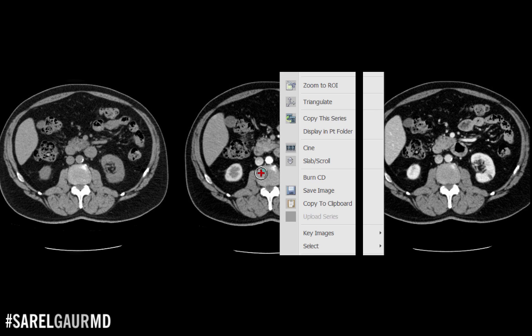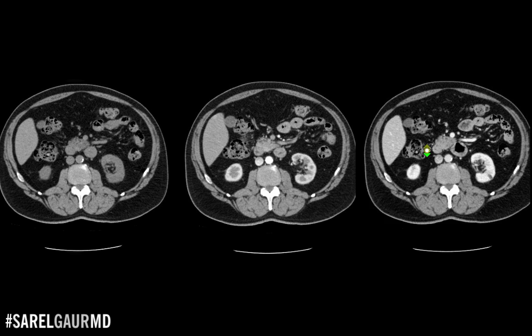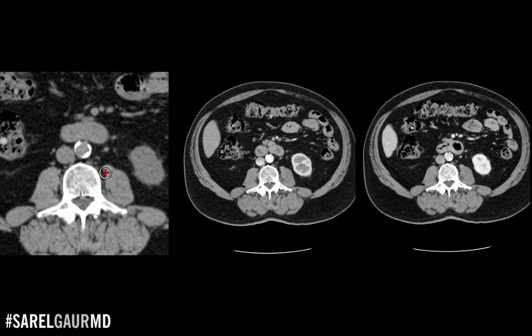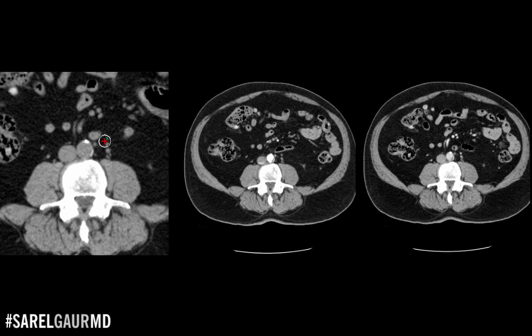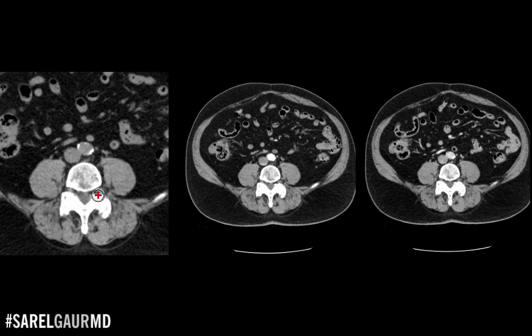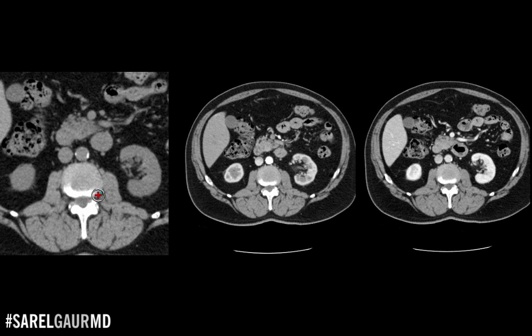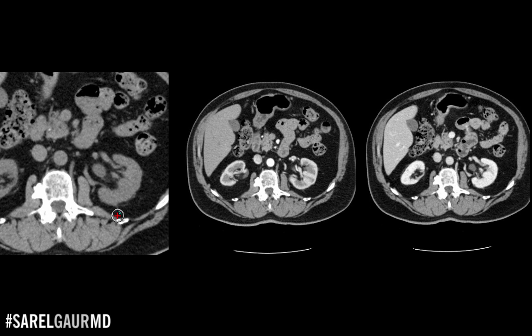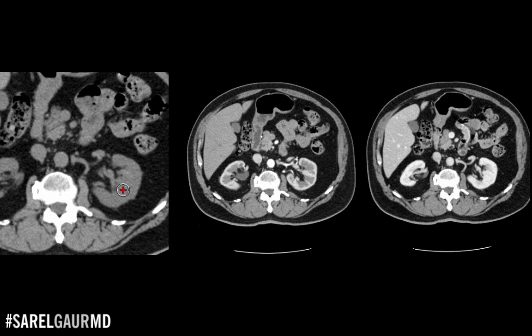This series here, all the way on the left, is a non-contrast CT study. What I'm really seeing here is a density map of the body, based on the Hounsfield scale, with the grayscale adjusted to a particular window width and level. I can see that the bone is really dense, the kidney is less dense than bone, and intra-abdominal fat is less dense than the kidney.